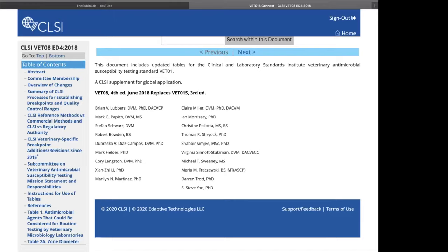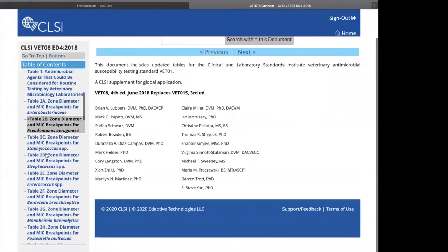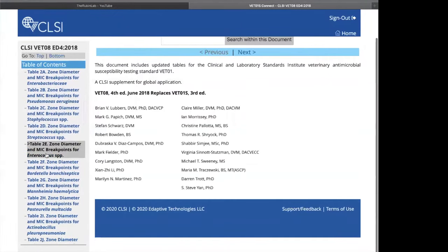This is the online version of the CLSI guidelines where we find our interpretive criteria for susceptibility tests. And as you can see over here on the left, we have all of the different organisms we might be interested in listed. This is where we'll find each of our sets of breakpoints.